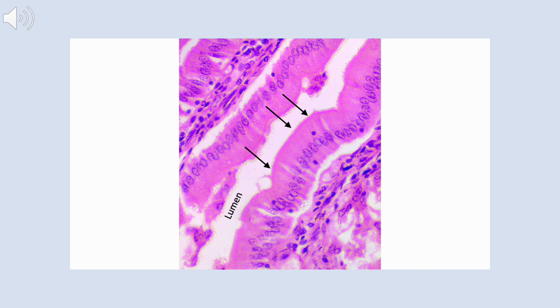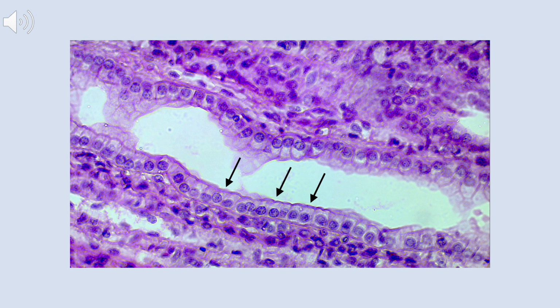If you hold your two fingers up in like a V, then the surface of your skin that's facing each finger would be what we're seeing here. Now, the actual type of epithelial tissue we can tell by looking at the nuclei and the cells. If I look at the nuclei, they're all arranged in one row, so that indicates it's a simple epithelium. They're oval and they're polarized. That is, they're closer to the basement side than they are to the apical side. That tells me that they're columnar. So we have a simple columnar epithelium on this slide.